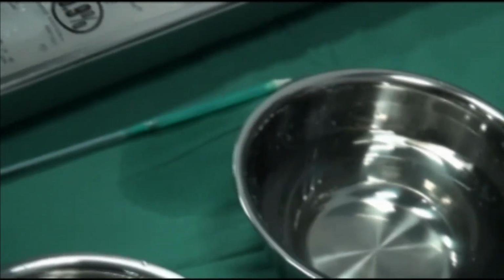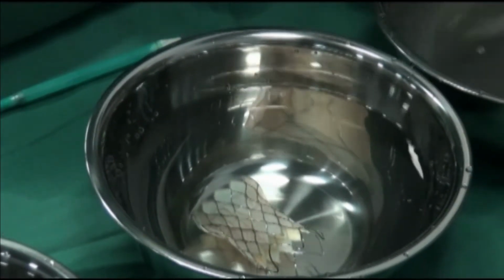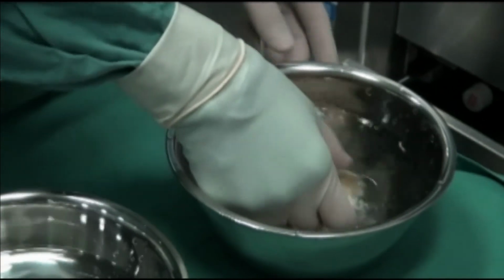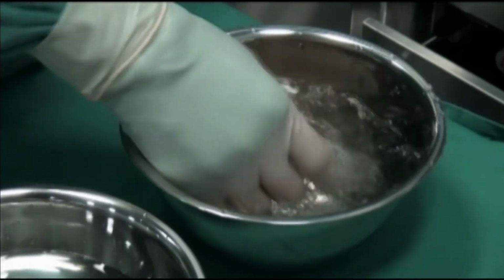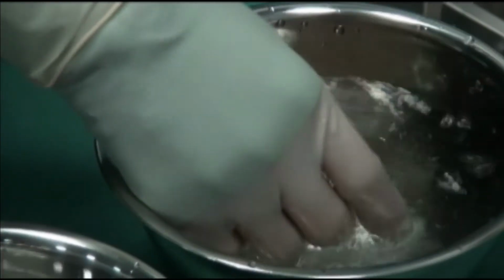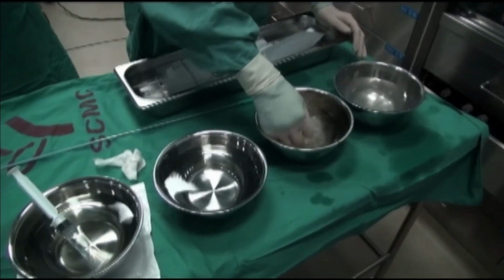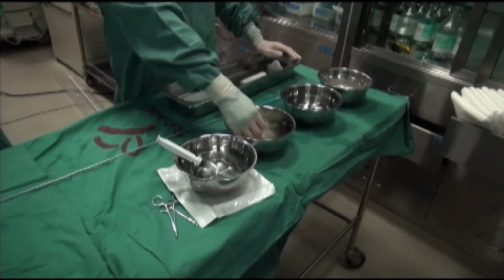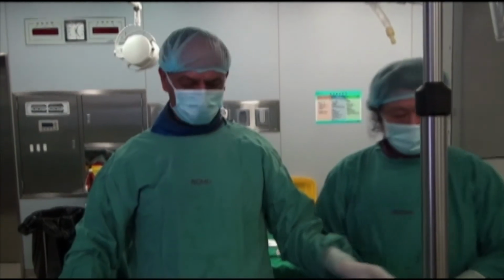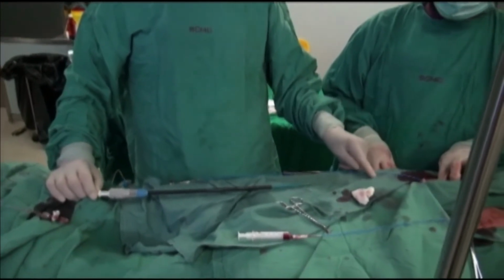Okay, now we will prepare the valve for cleaning. So we will wash the valve. We use 3 bowls, each one with 500 cc saline, and we wash each one for 3 minutes, shaking 300 times for each bowl. Second one, the last one. After that, we clean, and we will put it in ice water for crimping. And Dr. Hajadi is showing the delivery sheath, the sheaths.